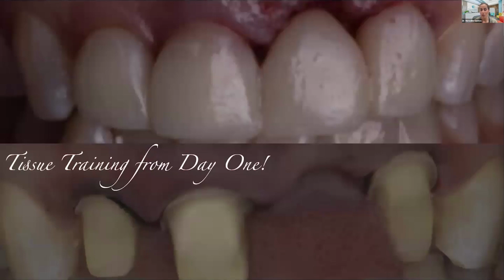The other thing, again, which we kind of talked about a little bit with some of your cases, is it really helps with that communication with the patient, because Carla really wanted her 8 and 9 shorter personally than what I wanted. But this was Carla's aesthetic. She wanted 8 and 9 to be almost on the same plane, you can see, as 7 and 10. And so that was something where when I designed it, I didn't have it looking like that.